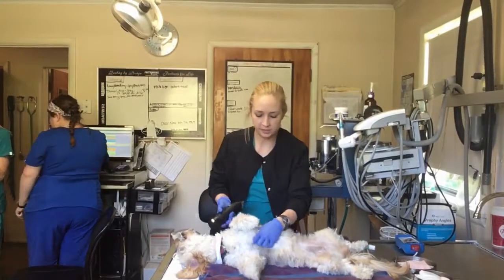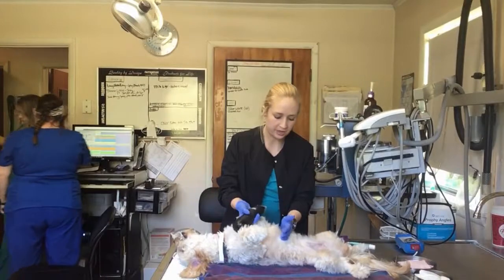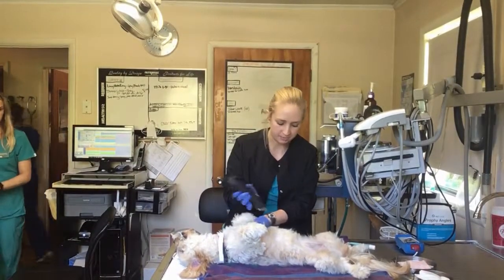I'm going to go ahead and start my clip and scrub, and to clip you're going to start right here at the xiphoid process all the way down through the entirety of her abdomen.